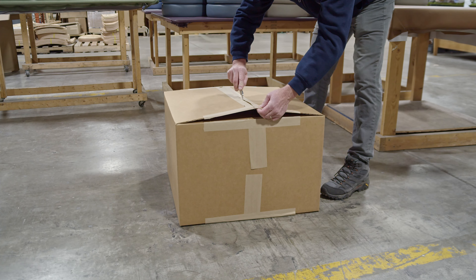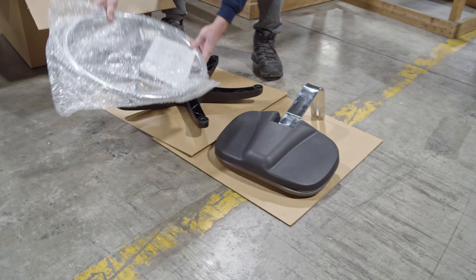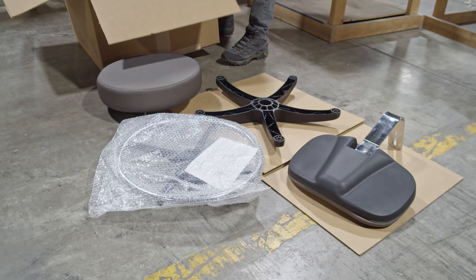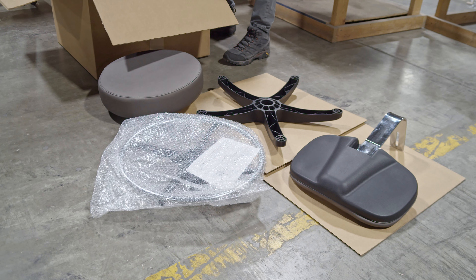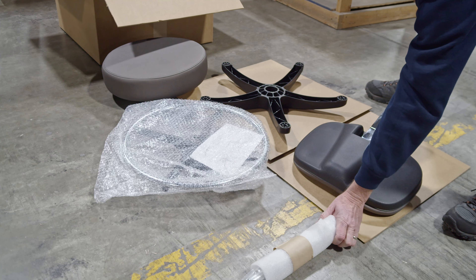Cut tape and open the box. Carefully remove the back, base, foot ring, and seat, placing each component on plastic or in a protected area. Finally, remove the remaining items from the box.